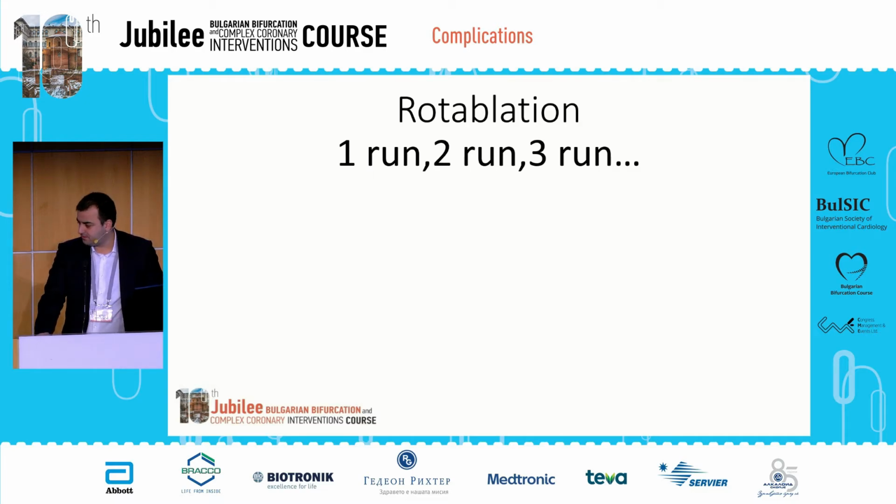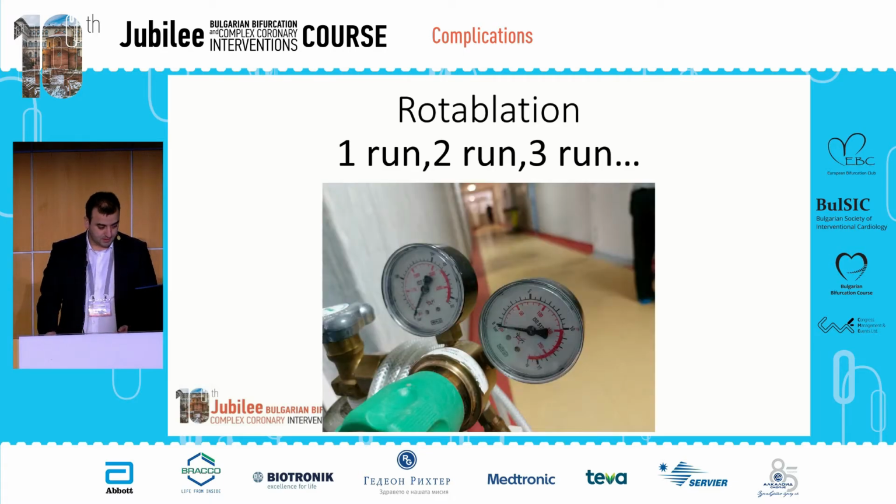rotablation, something went wrong, and the speed decreased. I said to the nurse, please increase the speed of the rotablator. She increased it, but nothing happened. Finally, I was able to pull back the burr. And this time we saw that we don't have gas in the bottle. It was a technical issue, and we stopped the rotablation.